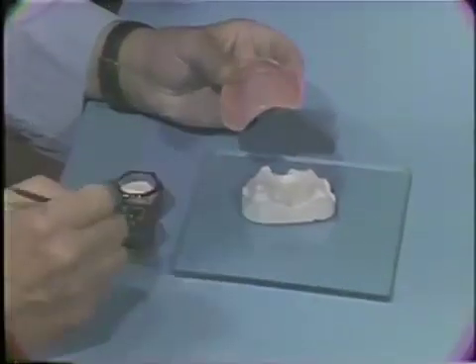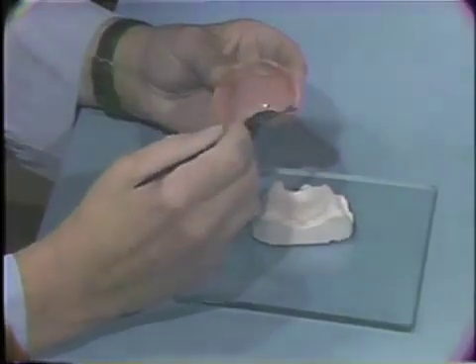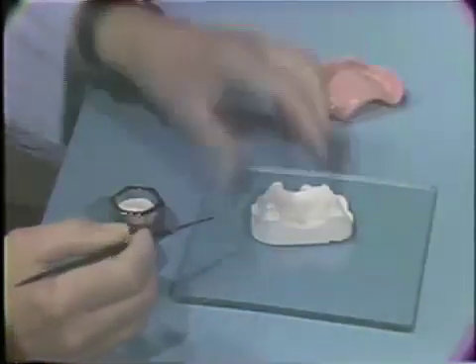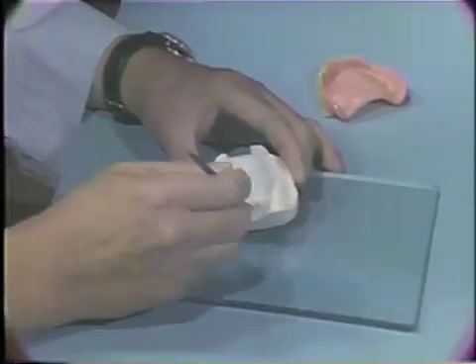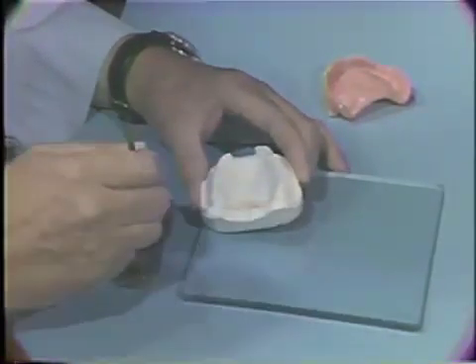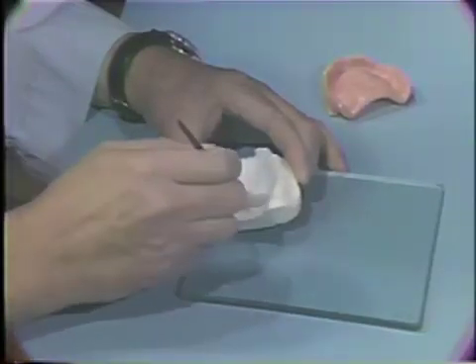Then, using a small paint brush, wet the prepared area of the maxillary denture with some of the liquid monomer. Then dip the wet brush into the powder polymer and paint some of the acrylic resin onto the posterior palatal seal site on the impression plaster cast.